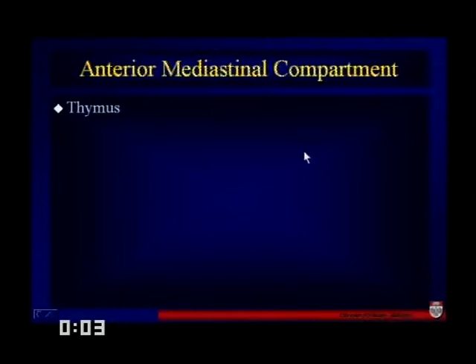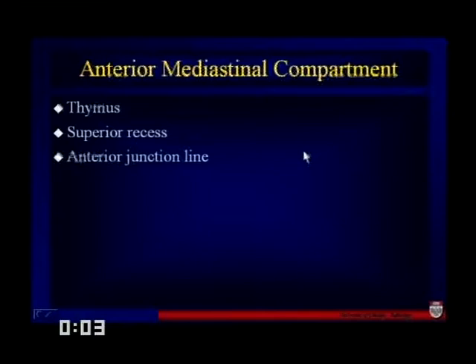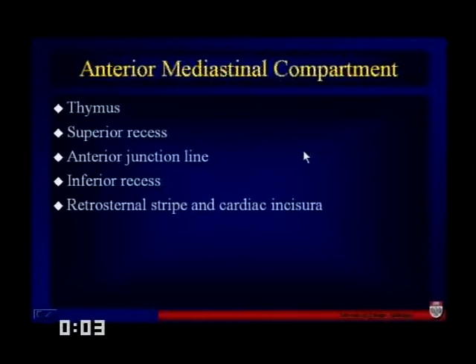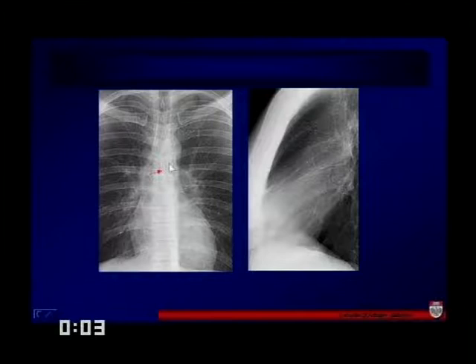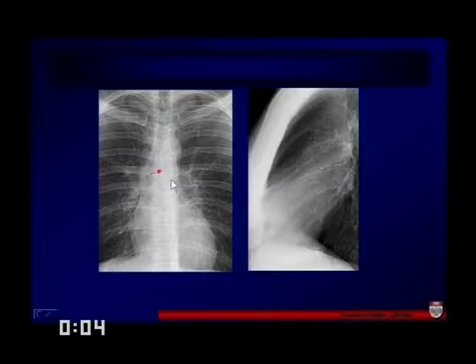In the anterior mediastinal compartment, we should see the thymus, a superior recess, the anterior junction line, an inferior recess, a retrosternal stripe, and maybe a cardiac incisura. Right here we can see a very nice anterior junction line. The importance of seeing an anterior junction line on chest radiograph is that if you can see it, you're almost certain there's not going to be any anterior mediastinal mass. The junction lines are formed by the two lungs coming together with their thin pleural surfaces.